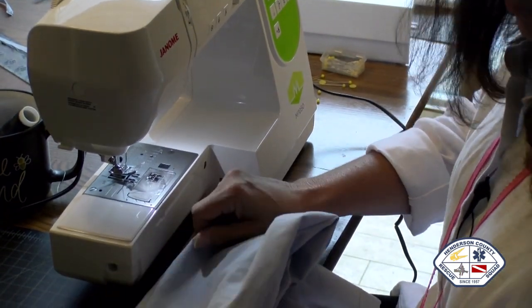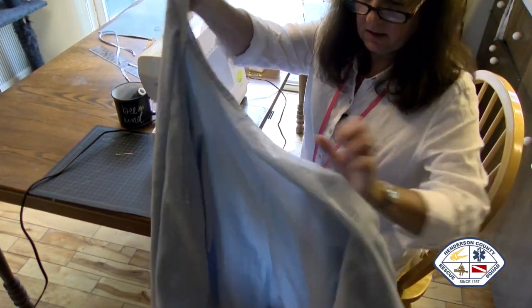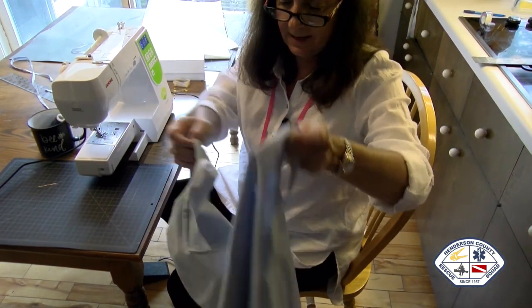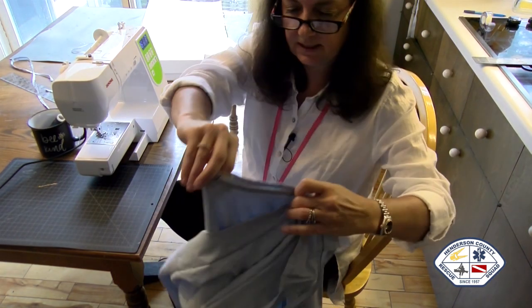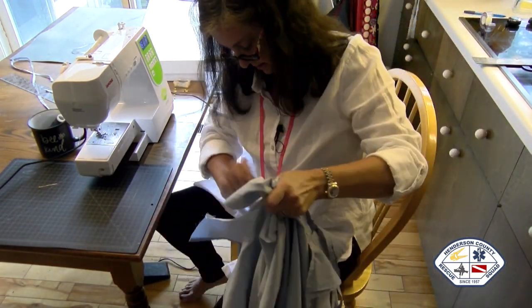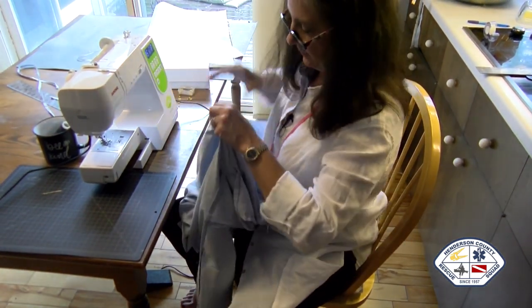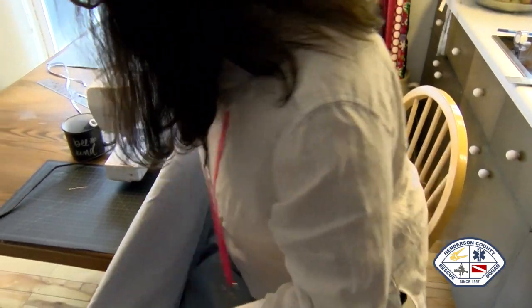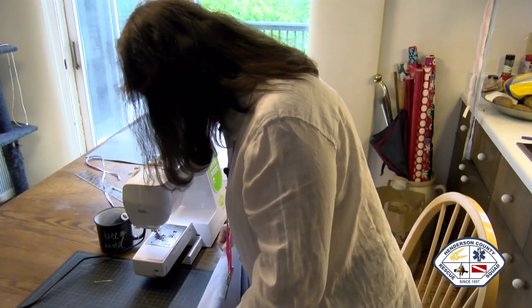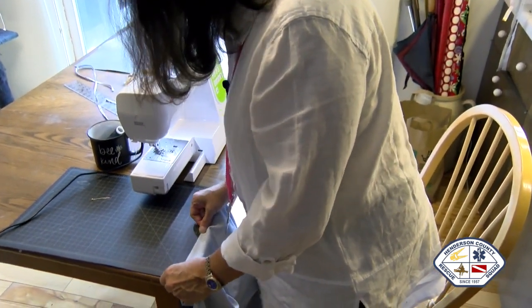Perfect. Okay, now we have a sleeve with a thumb hole. We have a neck. We have shoulders. We have backs that were already hemmed because we worked smarter and not harder. Now, one last thing. We are going to fold it in the middle at the neck. So let's see if we can get this in a straight line. There. Okay. We're going to measure down 15 inches from the neck. Now, I have 10 inches because I'm using a short ruler, and I have 5 inches.